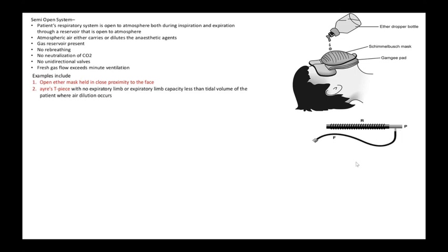On the contrary, if you have a valve like in Mapleson A, which I will show you shortly, it is that point which determines the apparatus dead space, because the exhaled gases are going out and patient will not rebreathe that. So the apparatus dead space is determined by the point of entry of fresh gas flow in the breathing system, or the position of the adjustable or pressure relieving valve. These are the two positions by which you should determine or calculate the apparatus dead space, and you should try to reduce the apparatus dead space as much as possible.